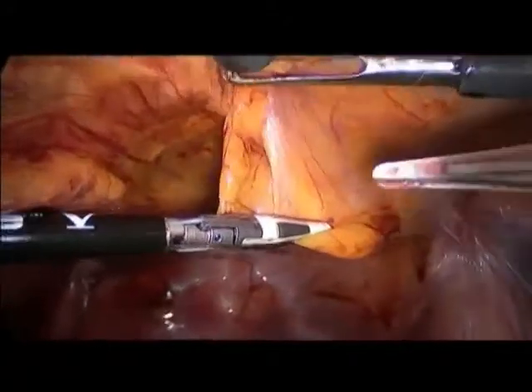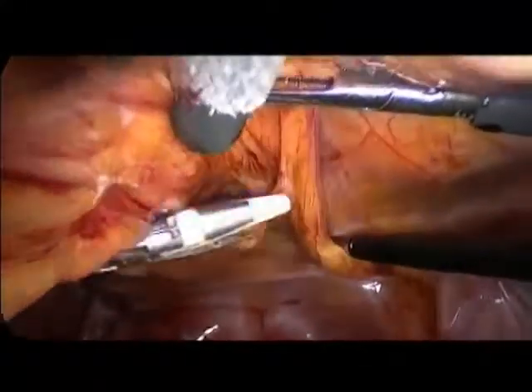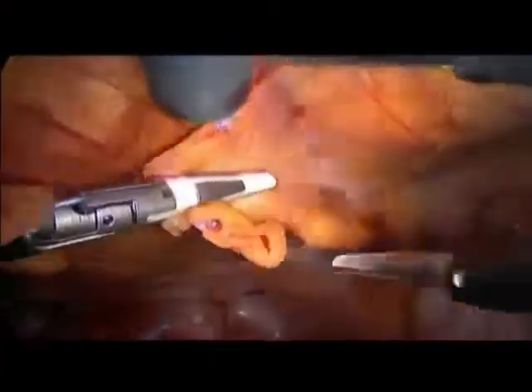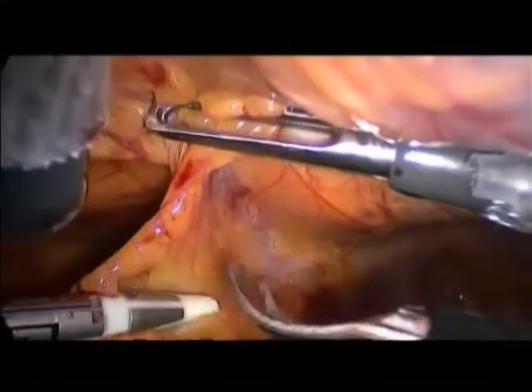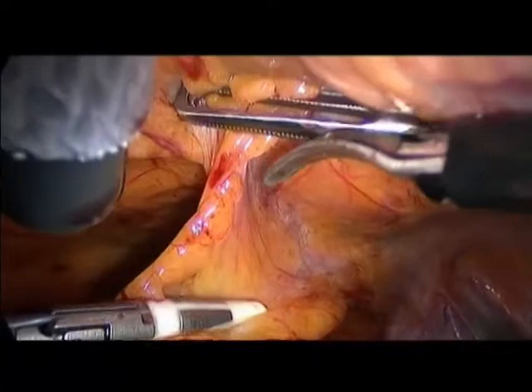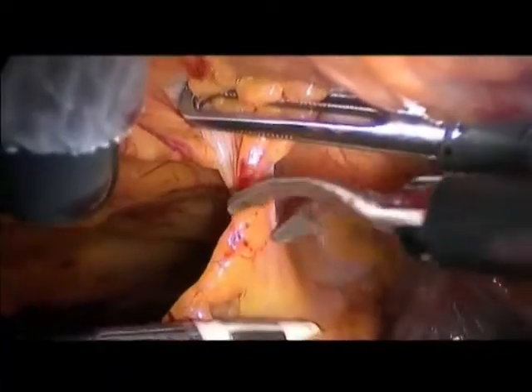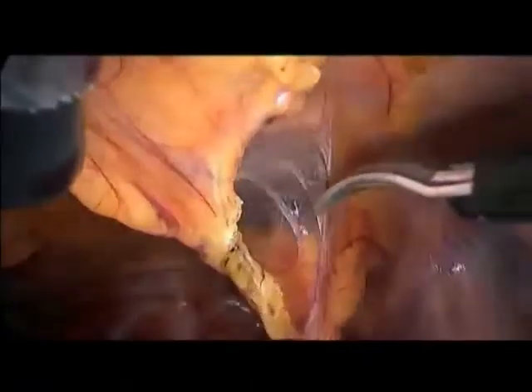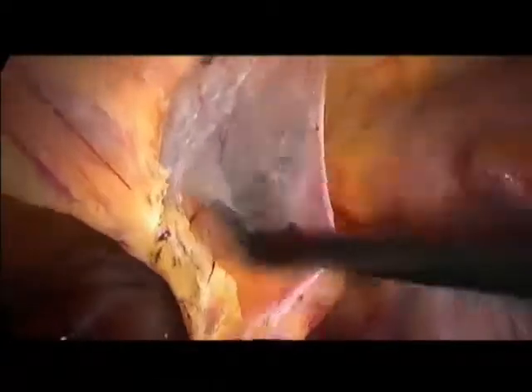and this allows us to avoid any trouble with the bladder fat, so that what I catch here is the right umbilical ligament, and there is an assistance by a counter push by the assistant, and we will immediately divide this right umbilical ligament. And just behind it, as you can see, you find immediately the areolar space of the retzius, so that there is no confusion about the level of cutting.